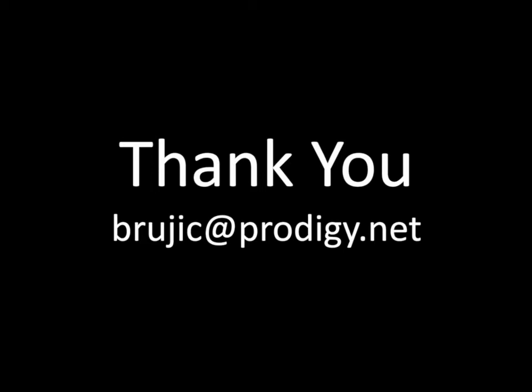But the pachymetry scan is actually, technically speaking, an anterior segment scan on your OCT. So for anterior segment OCT, whenever you're utilizing either the pachymetry scan or any of the angle measurements that you can use for your glaucoma patients, think of using the 92132 code as opposed to the 76514 code, which is the code we used when we utilized ultrasound pachymetry. I hope that clears that up, and if there are further questions on that, feel free to email me after.